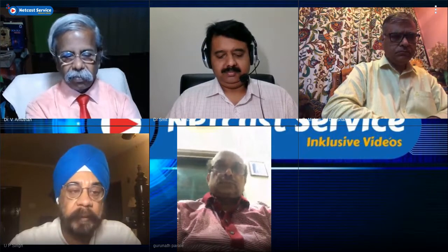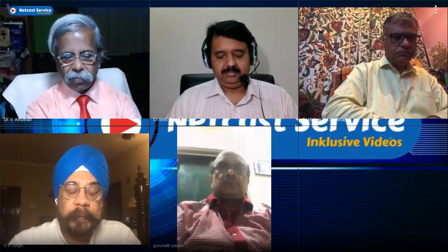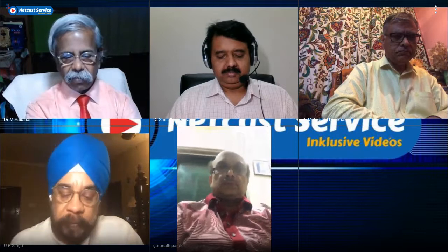So I think that is the strength, the ease of doing ejection fraction. It's far easier than doing it by the Simpson method. So why should I use the Simpson method, which takes about 30 or 40 seconds, when ejection fraction by heart model takes less than 15 seconds. So I think the paradigm would shift gradually.